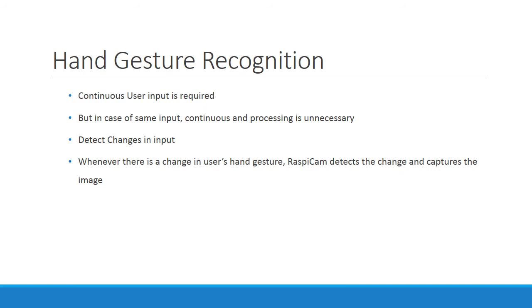Our technique requires a continuous input from the user. In case the input is the same, our program does not process it. It detects the changes in the input and only then processes it. The next part would be explained by my friend Aravindhan Vijayaraj.